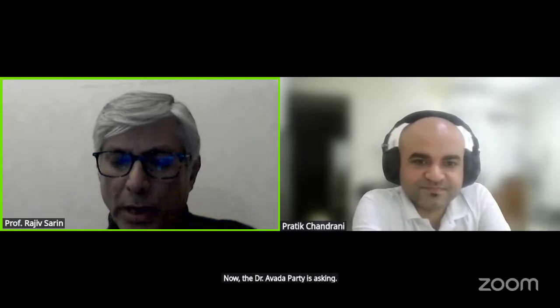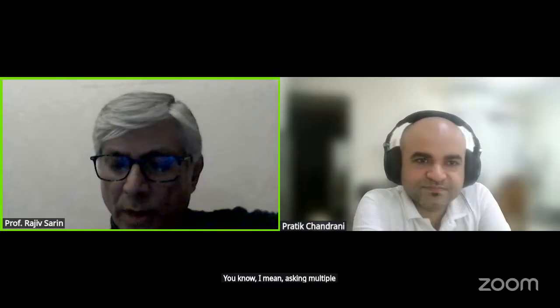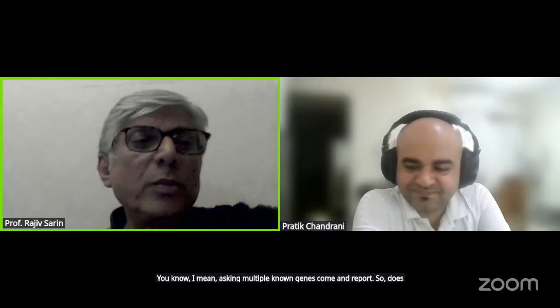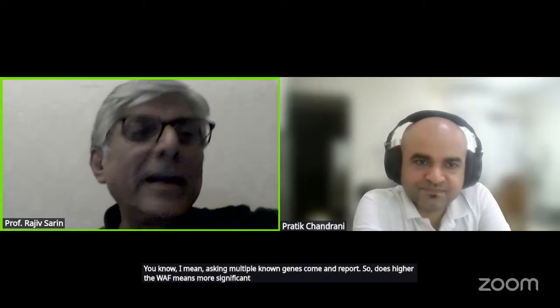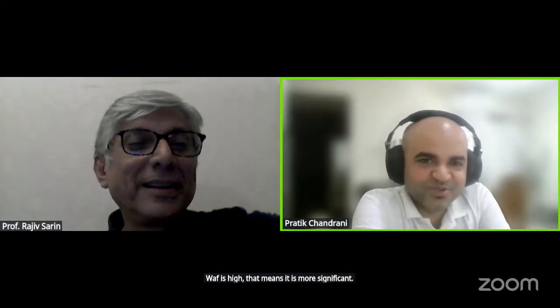Dr. Vada Party is asking how to interpret multiple known genes on a report. So does higher the VAF mean more significant? On a somatic, if VAF is high, that means it is more significant? No, VAF is not equivalent of significance.